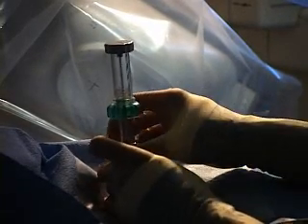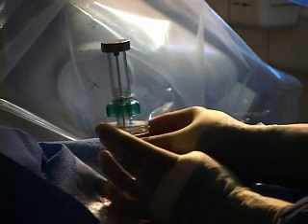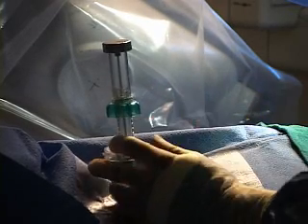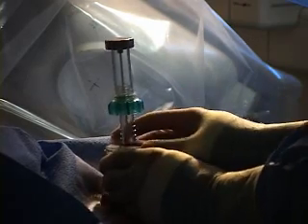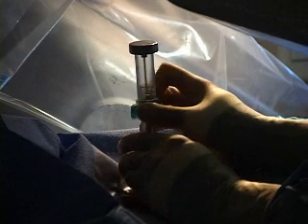Once that's threaded in, I'm just going to lock this thing down. That's probably the key part of what I did here — I gave this plastic component time to thread down. Now I can put the screw down.